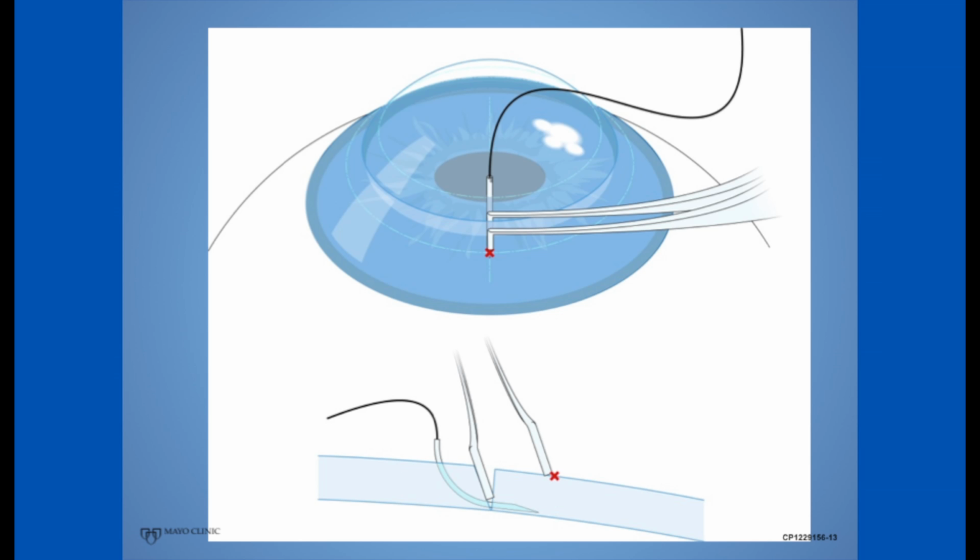Let's look at the component parts of the final product we wish to achieve. The needle is radial to the host margin. The needle is deep in the host and parallel to the posterior host surface and engaged 0.8 to 1.0 millimeters from the edge of the host wound.